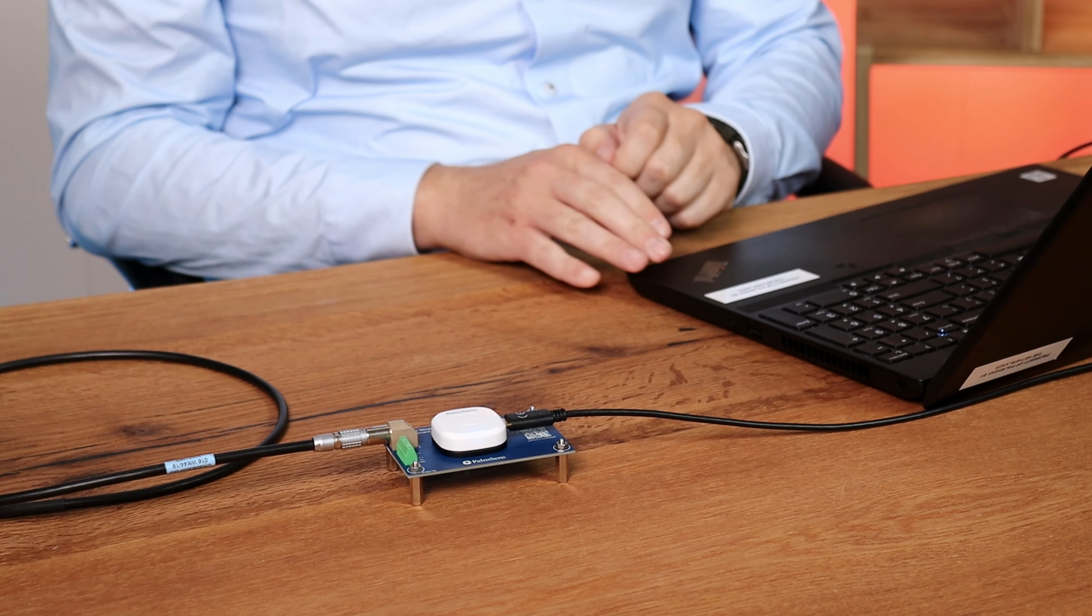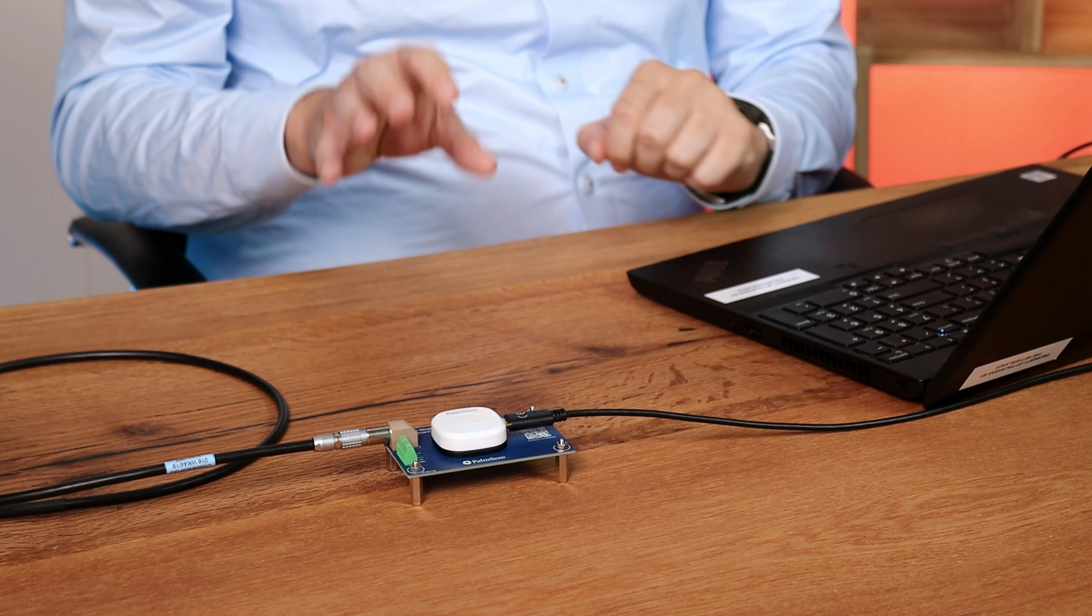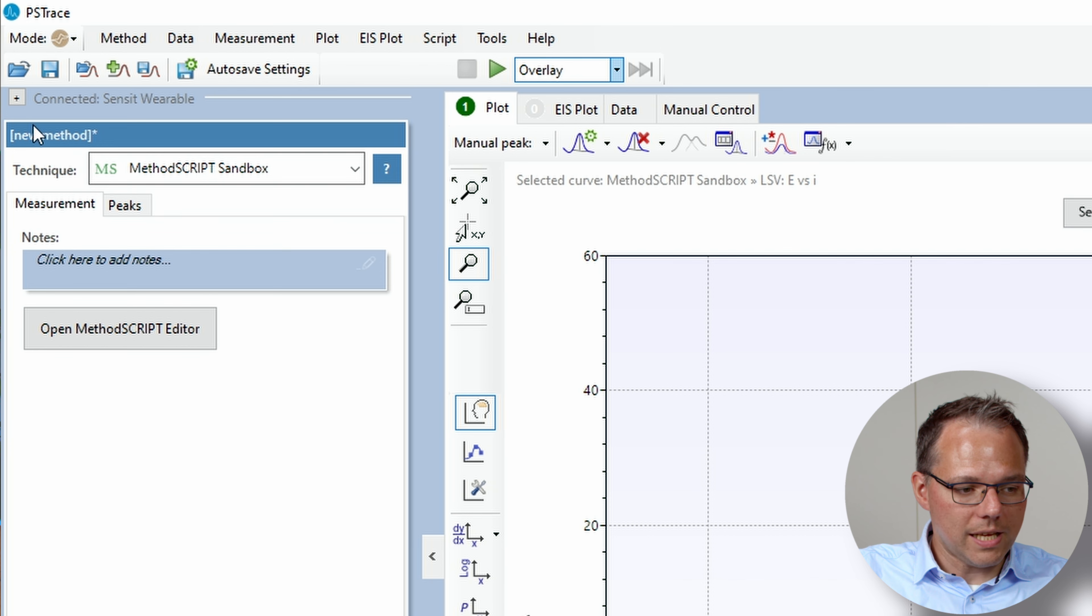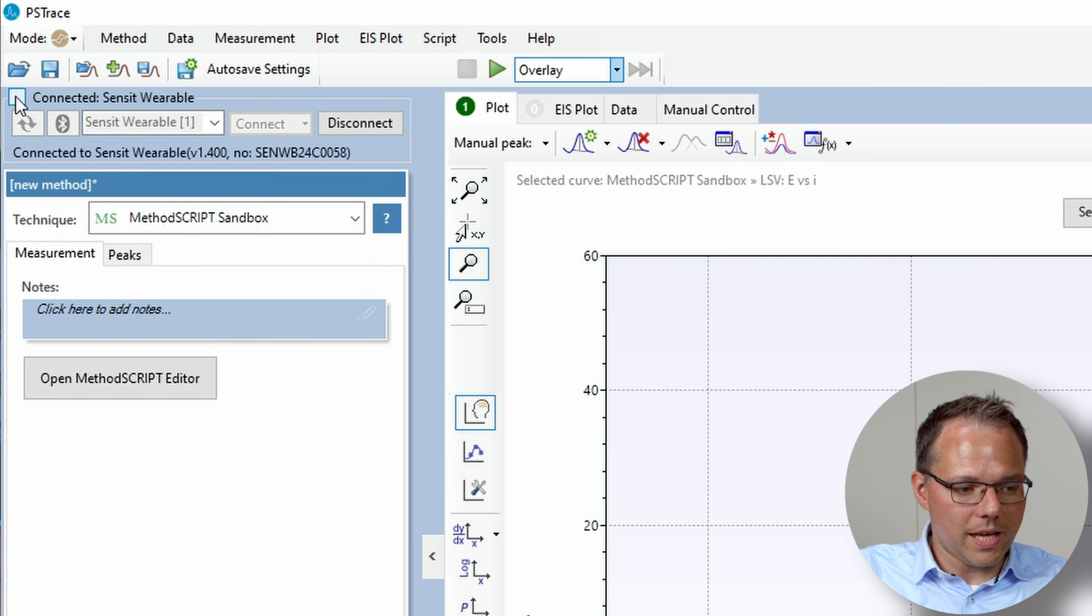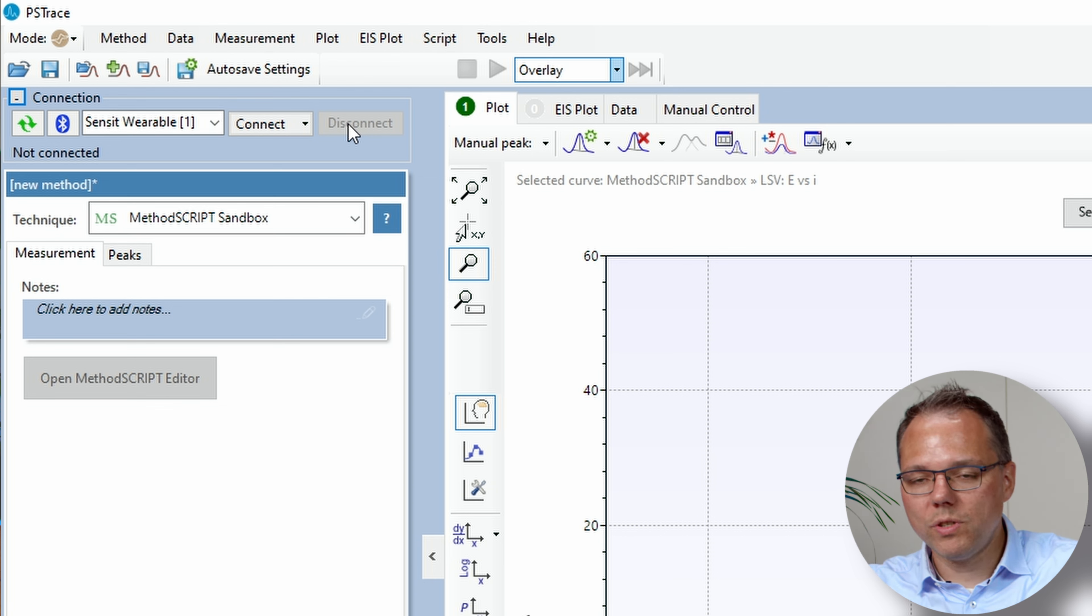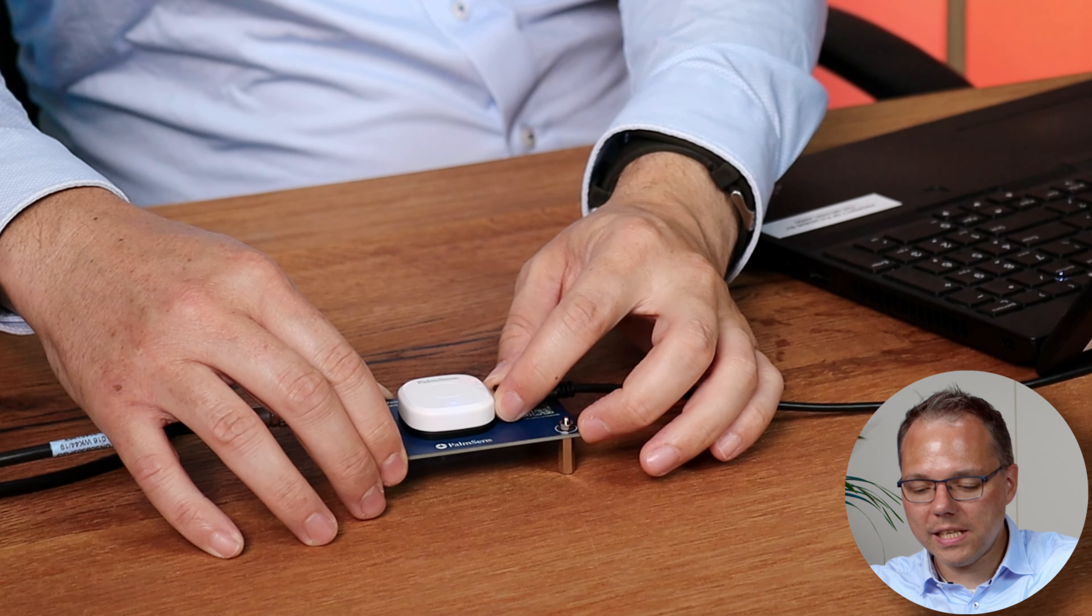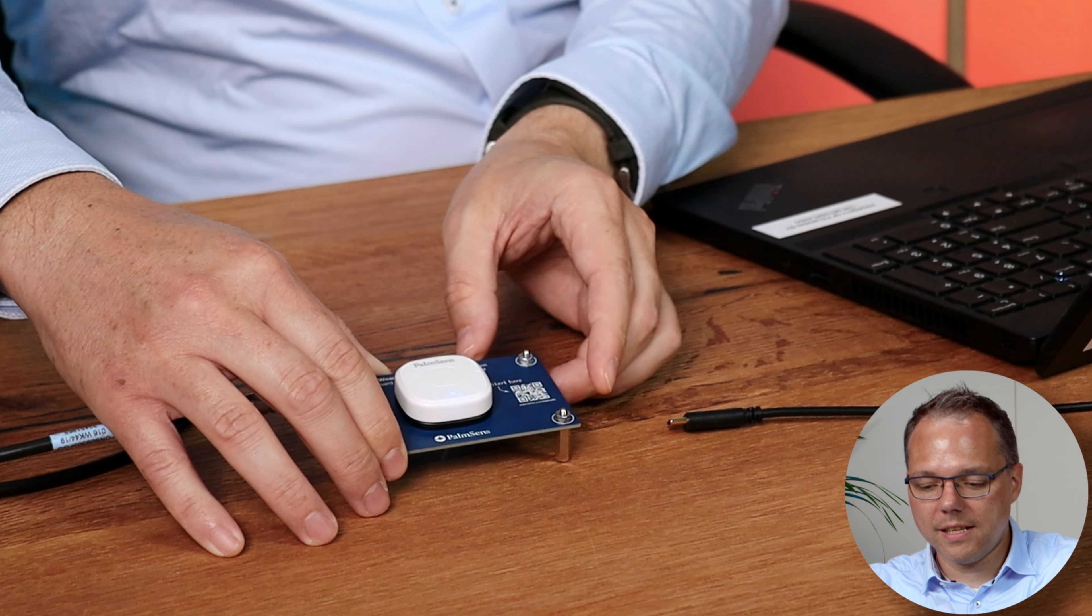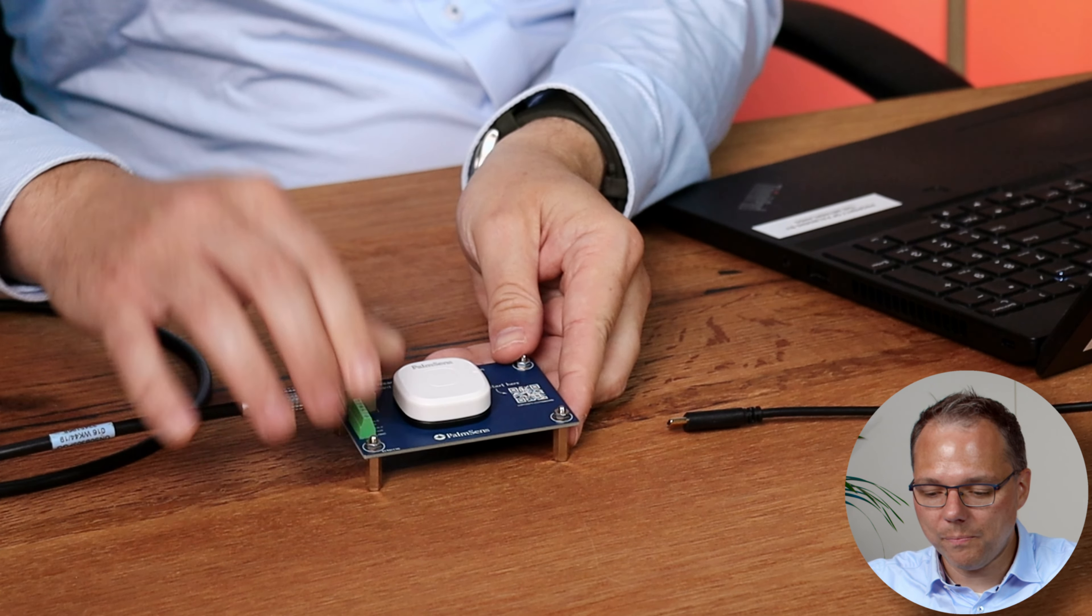So you know now that any measurement that we have after restarting the Sensit wearable and saved on the internal storage is really the one that was made there. So let's disconnect from PS trace and let's really physically disconnect the Sensit wearable.